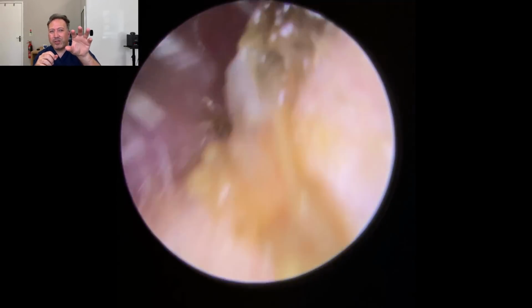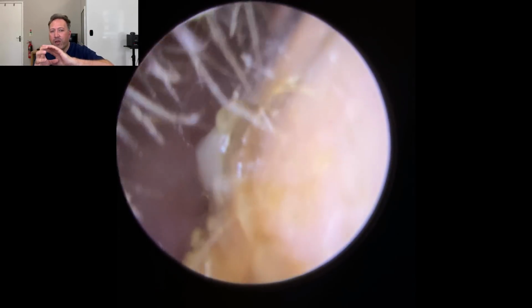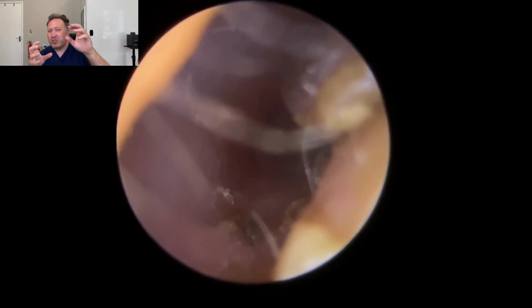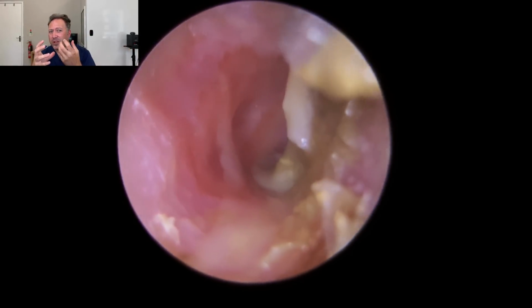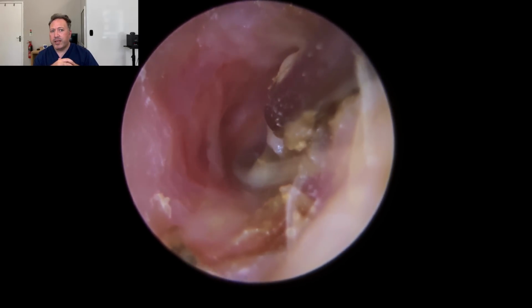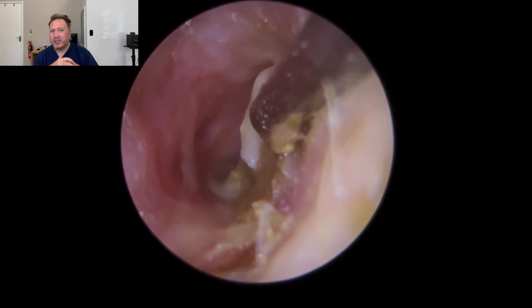Look what we can see now. You can see that there's remnants of it here on the outside. Look how liquid that wax is. So this must be getting moisture from somewhere. There must be a discharge in this here somewhere. Now we're just going to take away this section to the right-hand side.